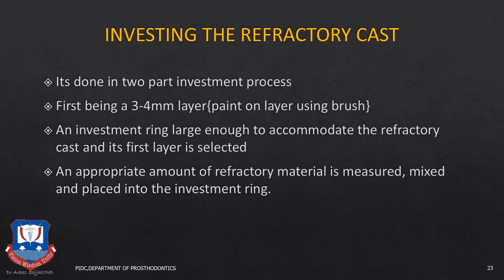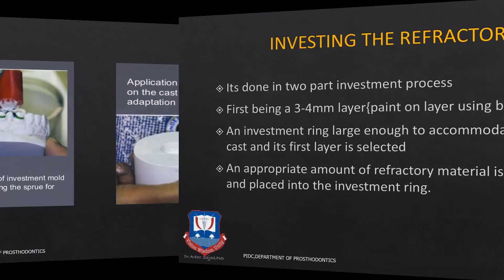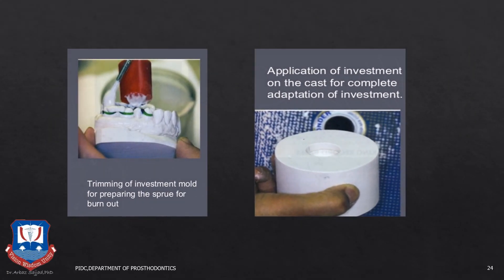The cast is now ready for spruing and investing. Investing is done in two parts — first a three to four mm layer — and is similar to how we duplicate a refractory cast. We invest the refractory cast in an investment material which has the same thermal and hydro expansion as the refractory cast. Spruing is done once the wax pattern is fabricated. A large reservoir is attached to the wax sprues, which are then attached to the framework, and this is then invested in the investment material of choice.